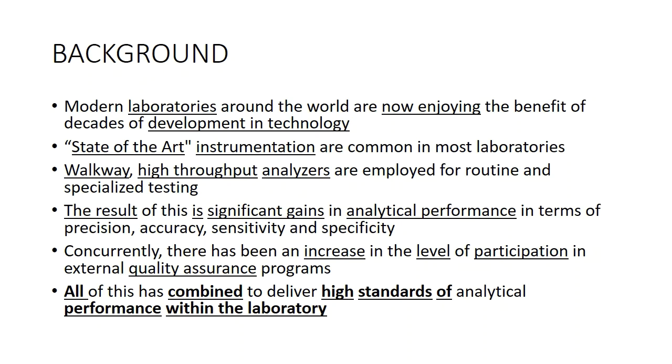But in spite of that, even globally, outside India also, ultimately the pre-analytical area is still much more human dependent, and that's why almost 70% of errors happen in this area, right?